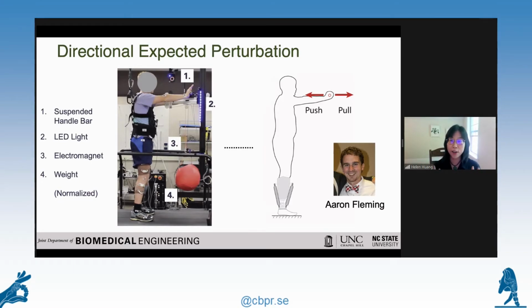It is actually very difficult to adjust the control in this case. And there is also compensatory control: when the ball hits you, you react to it. So there are two stages. We want to see how the person would generate anticipatory and compensatory control through the EMG control of that ankle. And then we set up an experimental system.